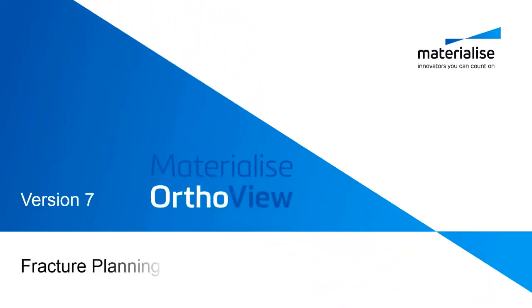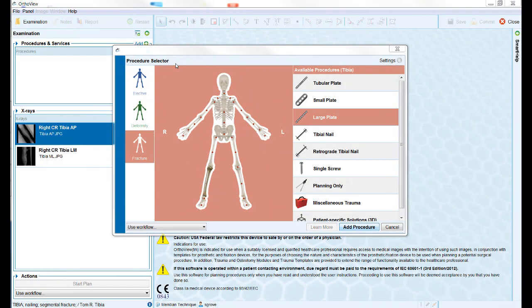This short materialize author view training video covers the use of the fracture management tools within the software. After loading the patient study into the planning software, use the procedure selector panel to choose the fracture option.